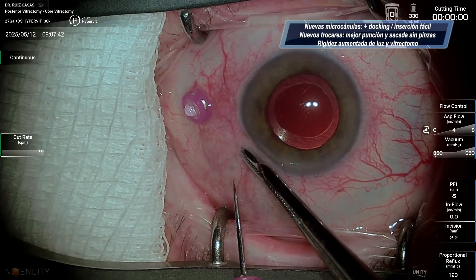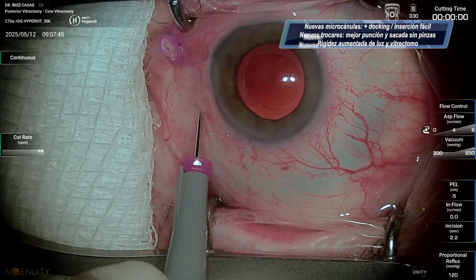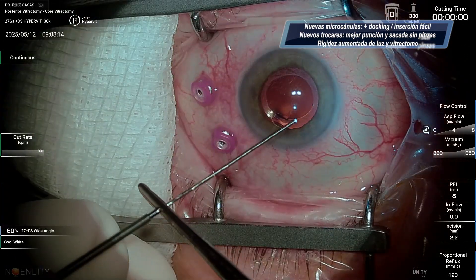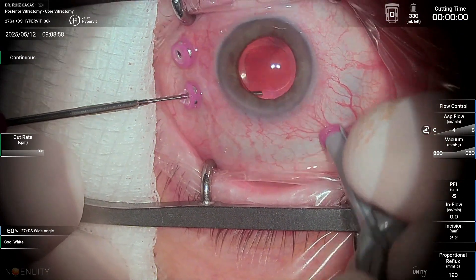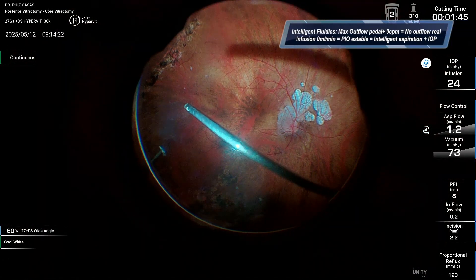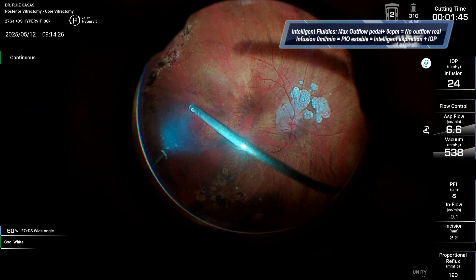You can see these special micro cannulas that help you to insert them into the eye without holding the micro cannula, and they also make it easy to put instruments in. You see the mobile shaft that helps you to increase the stiffness of the instruments, the excellent illumination, and the vitrectomy probe.